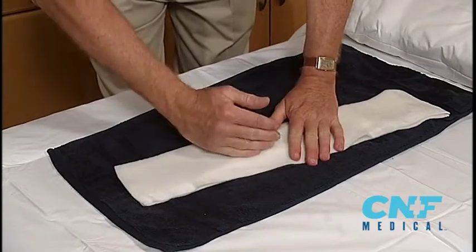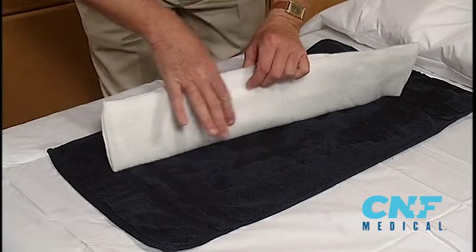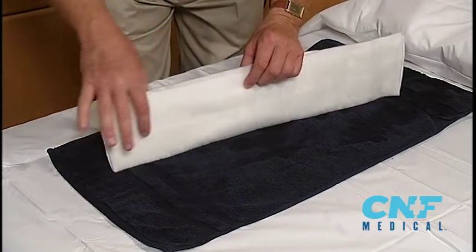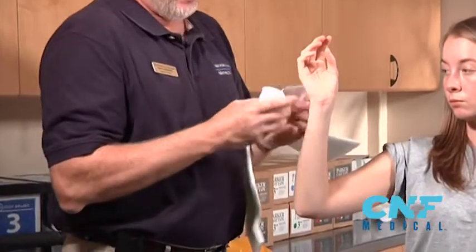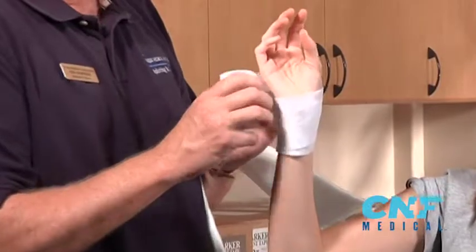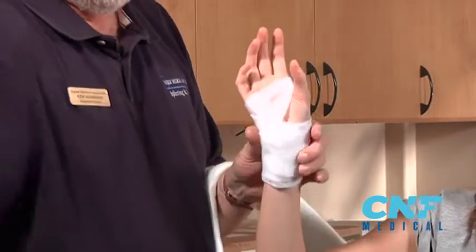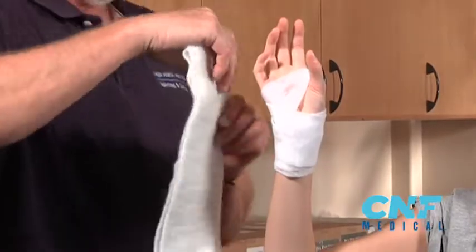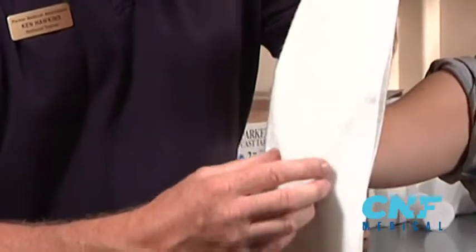Because you fold it this way, make sure this smooth side goes to the patient. You have that ridge on the other side — you want the smooth side to the patient. Now remember to pad any bony prominence. Loosely three or four times, come through the hand just one time. Place it back on the patient, making sure that hourglass goes right at the middle of the elbow.